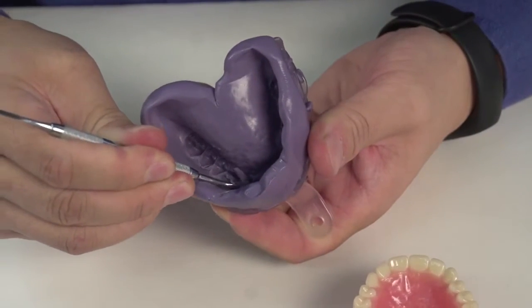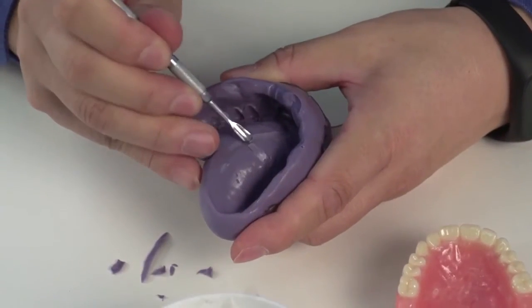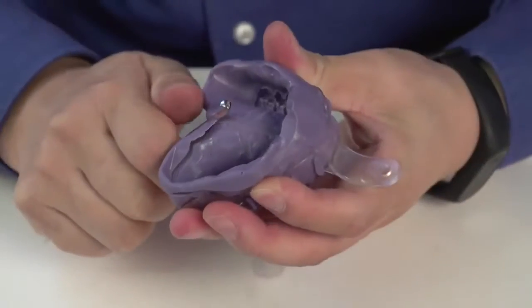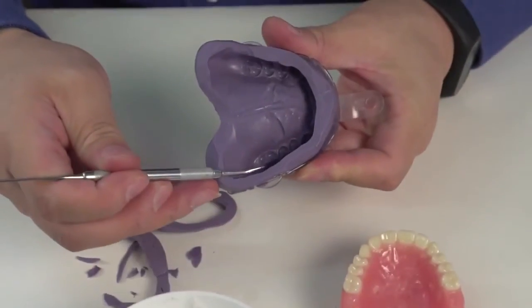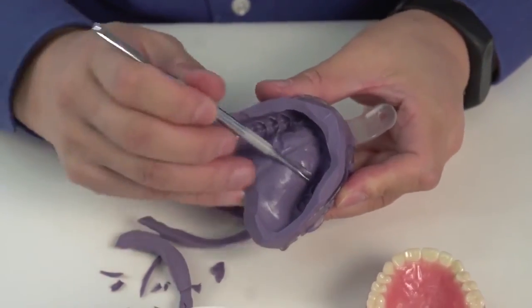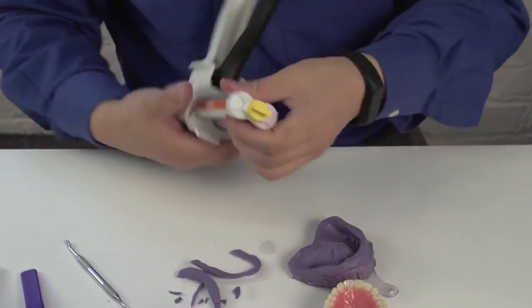Before applying Perfit light body impression material on the first step impression, use the Perfit silicone knife to remove gingival margin, papilla, and undercuts that engage teeth in order to make space for the second impression material. Cut sprue channels to allow the light body to flow up and out. Now, inject the light body for the second impression.